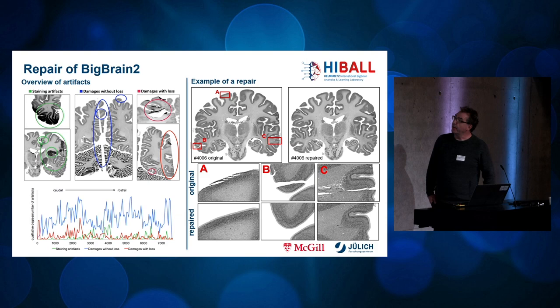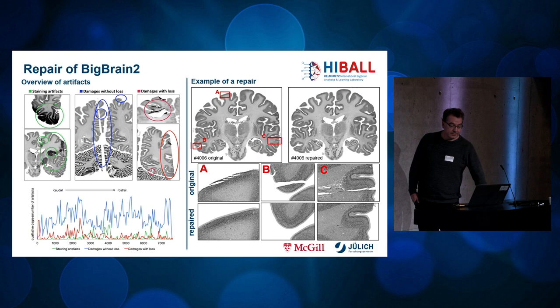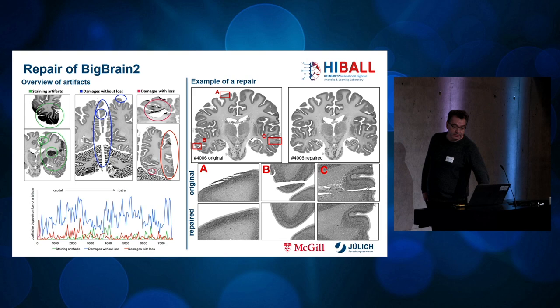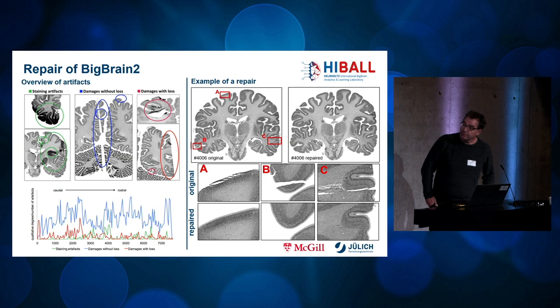Although most histological processing steps were carried out with a lot of know-how in our labs, the digitized histological sections show a large number of artifacts, and most of these artifacts must be repaired to achieve a good 3D reconstruction. In order to record the artifacts both quantitatively and qualitatively, we have divided them into two or three groups: staining artifacts, damages without loss, and damages with loss. The diagram shown here shows the distribution and strength of individual artifacts as a result of manual classification, revealing that about 30 percent of all sections must be repaired. An example of a repair is shown on the right side.